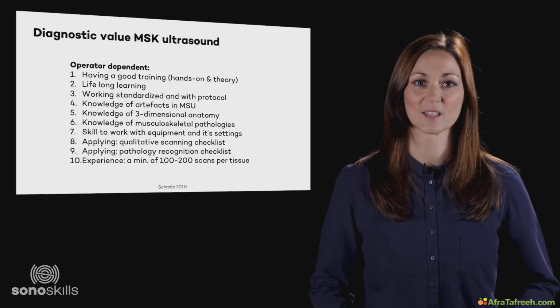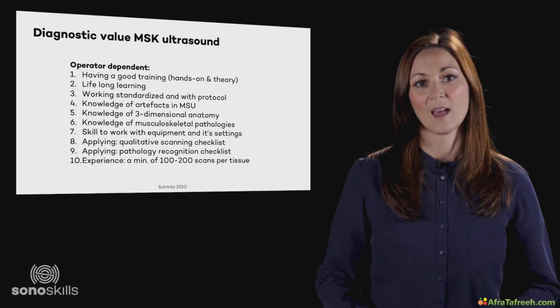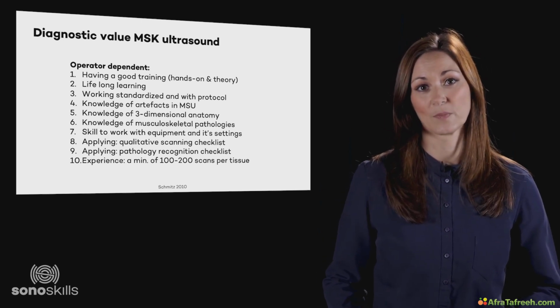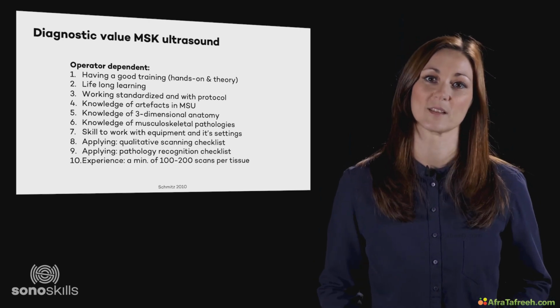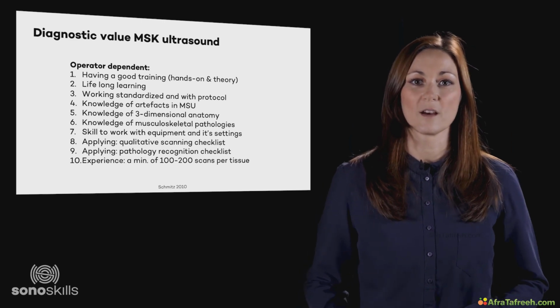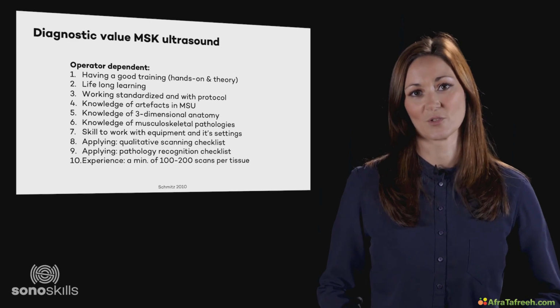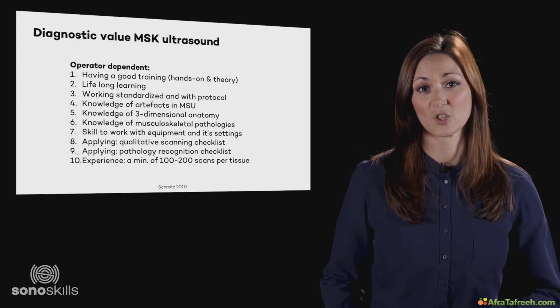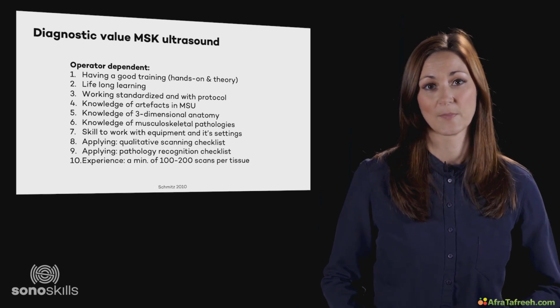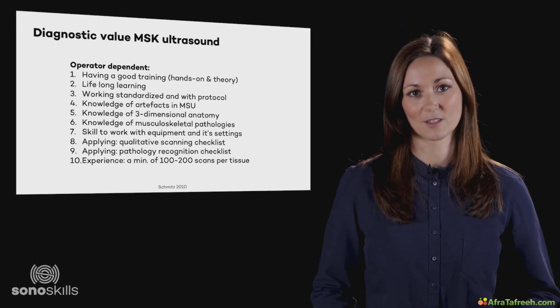The best sonographers assess the patient with one hand holding and steering the transducer and the other hand on the ultrasound system. Every movement with the scanning hand leads to adjusting and optimizing the system's settings with the other hand. This leads to making quality images and more diagnostic accuracy. You will learn in two other presentations about the checklists you'll have to use while scanning. And last but not least, again, make sure you have lots of experience.